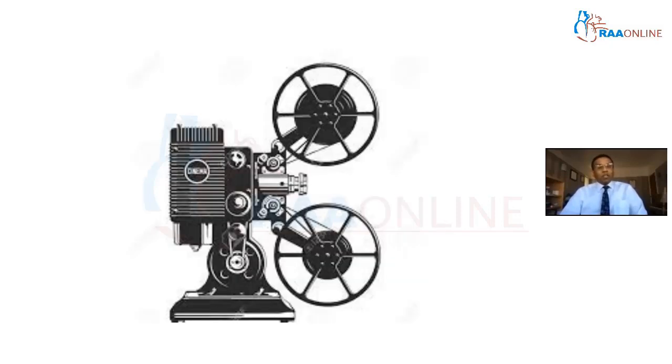Now, if we stretch our imagination a little bit further, and if we can visualize all of us sitting in a cinema hall, that's nothing but us sitting inside that pinhole camera cardboard box, with the projector hole acting as the pinhole, and the screen in front of us will be the image capture screen. Clearly, it's one big camera obscura.